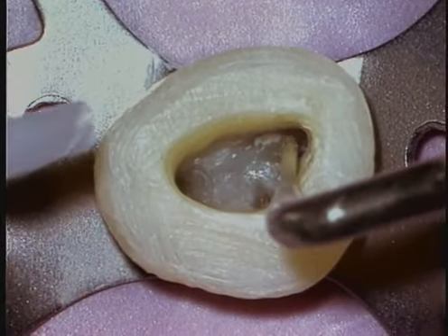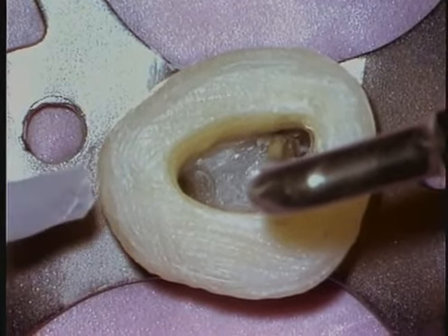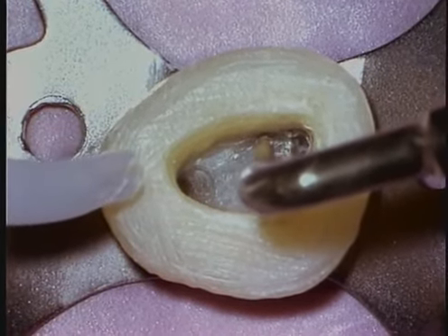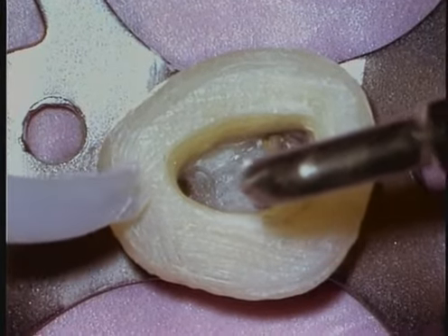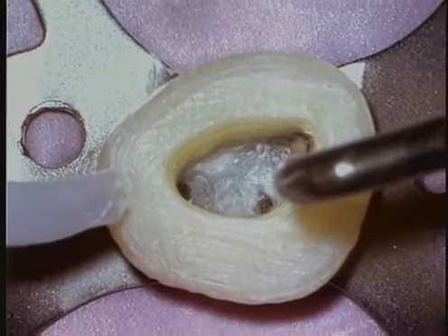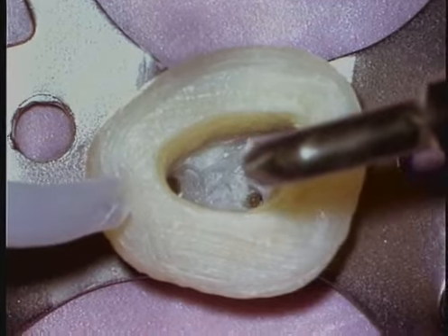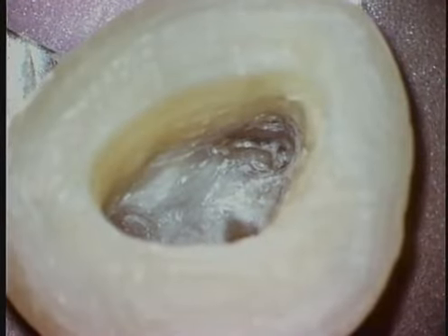This would be a good time to show the power of transillumination. Once the access has been roughed in, ultrasonics is employed to begin chasing along the groove that emanates off the MB1. Recall the breadth of the MB root in its buccal lingual dimensions and notoriously having the furcal side concavity.